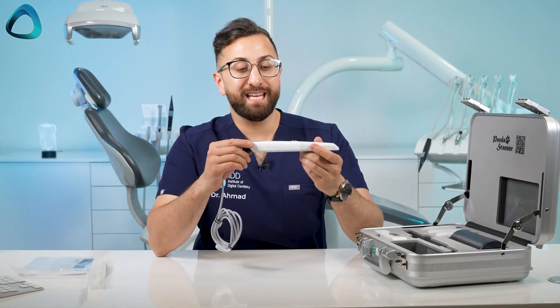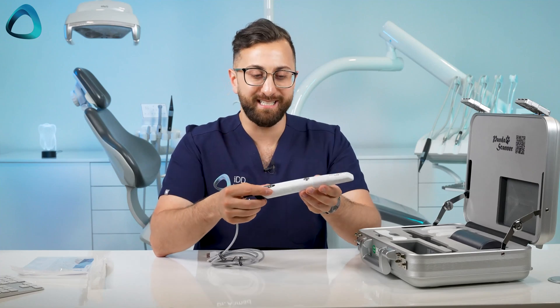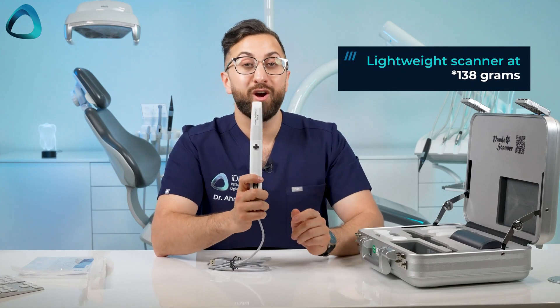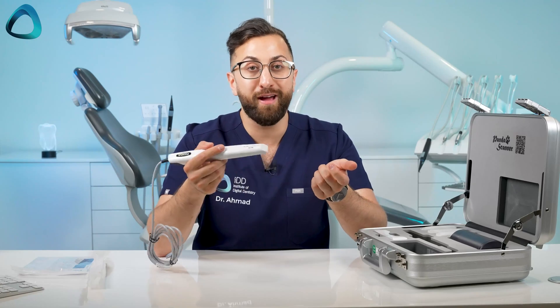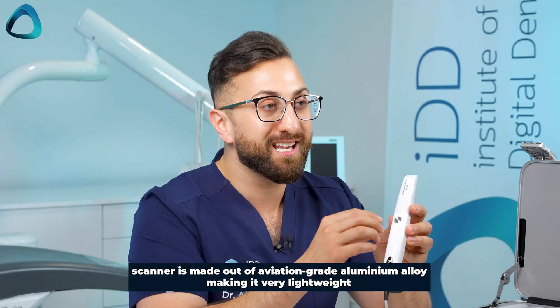One thing that really jumps out at me about the scanner is just how light it is. The company tells me this scanner weighs 137 grams, which is kind of crazy — that's something like an iPhone. Honestly, it almost just feels like a heavy fountain pen or something. It's incredible how these companies are packing so much technology into these lightweight products.